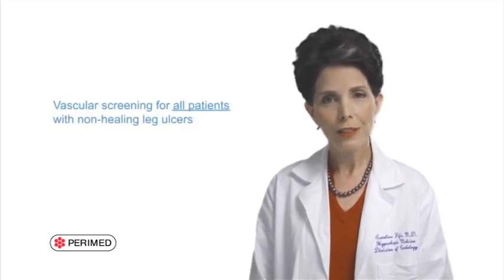It will not be possible to perform one transcutaneous study and obtain all possible answers to all questions. Current evidence-based guidelines by every major professional organization emphasize the importance of vascular screening for all patients with non-healing leg ulcers. As a clinician, if you develop a protocolized approach for performing transcutaneous oximetry on all your leg ulcer patients, your confidence in this technology will increase and your patient outcomes will improve.